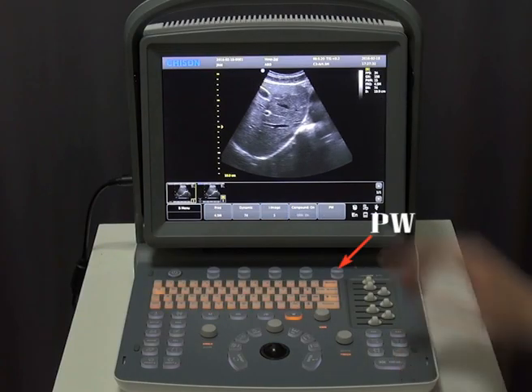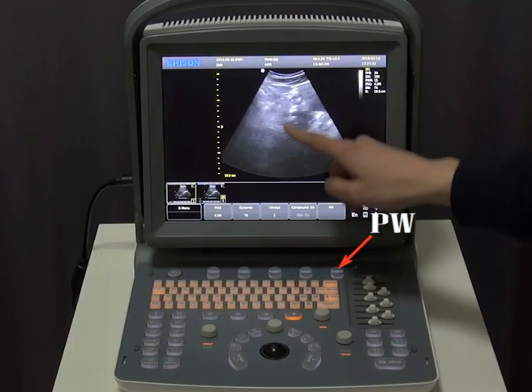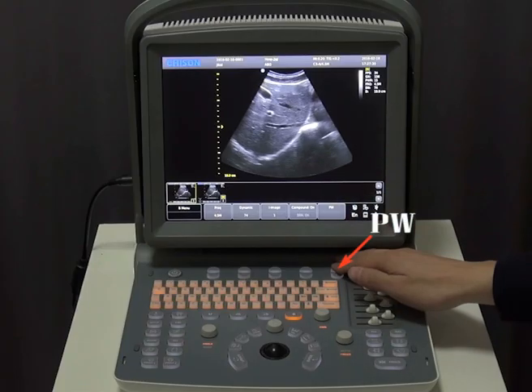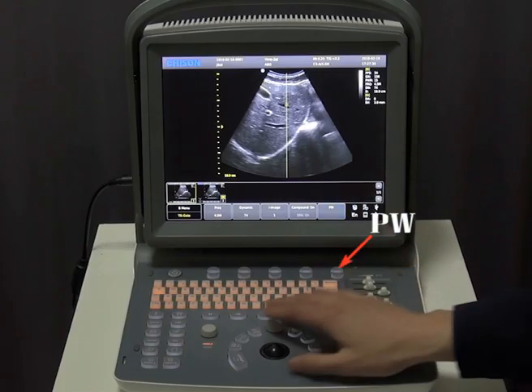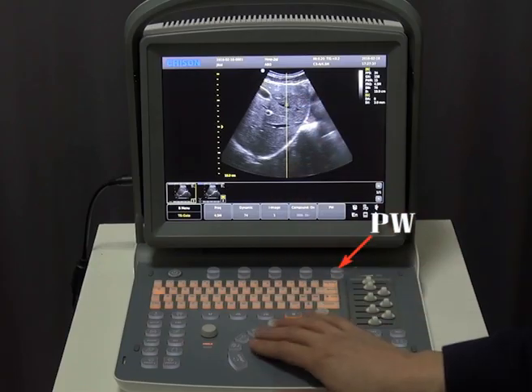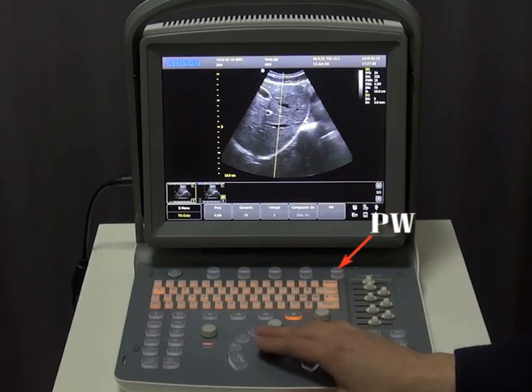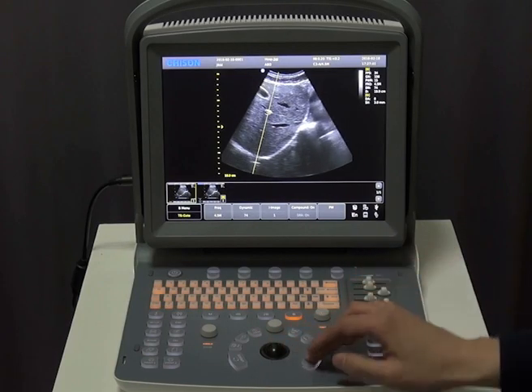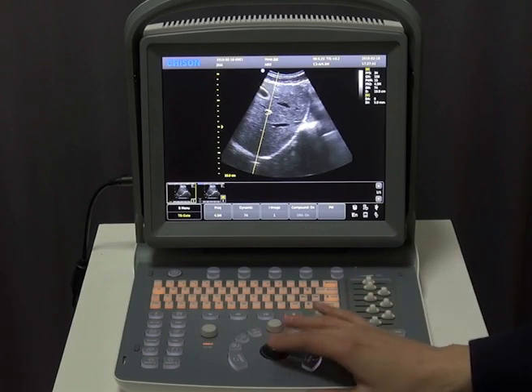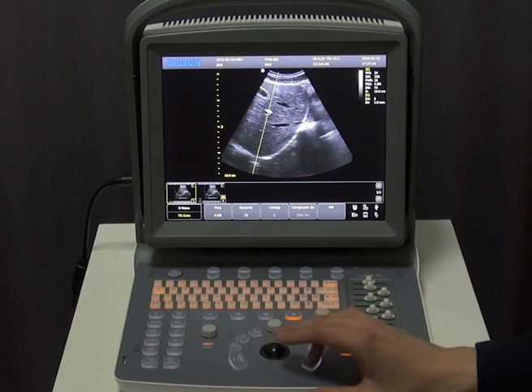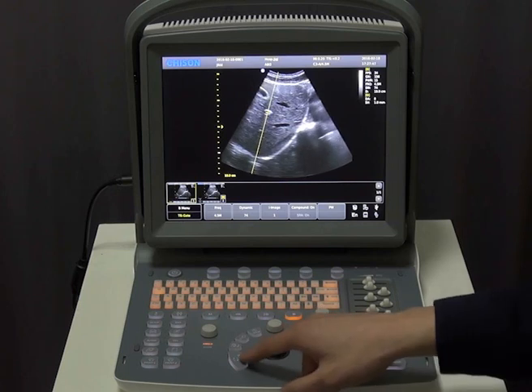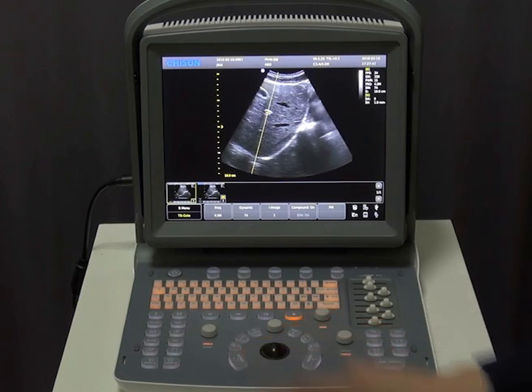Then we move to PW mode. Press the PW key, which is the fifth key located on the top of the panel. Press the Enter key to change the gate, and press the Angle key to change the gate angle. Then press Update to get the spectrum.